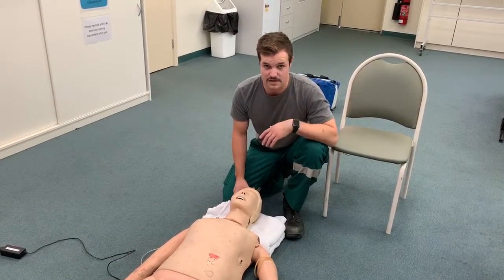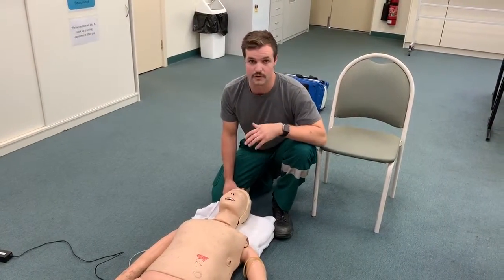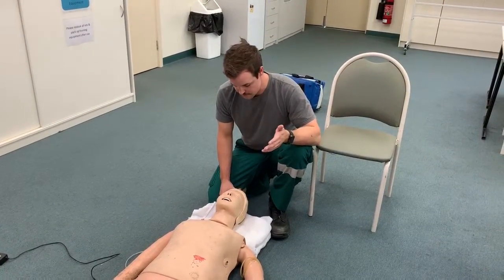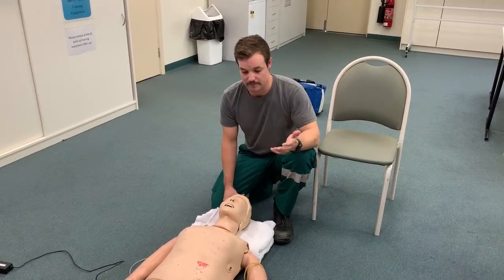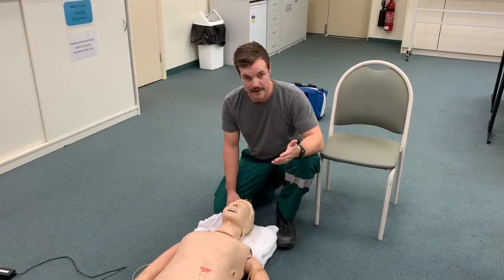For any considerations in any sort of airway assessment, either the conscious with Aaron or the unconscious with our mannequin, we need to have an early assessment, and prior preparation is key. We need to make sure everyone in the room has the same idea and the same plan of what's going to happen. In complete airway obstructions, we've got to have a plan.